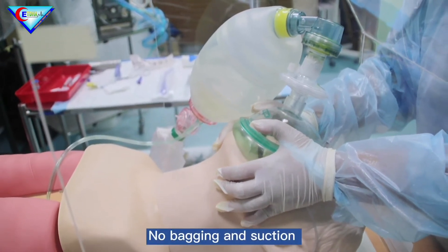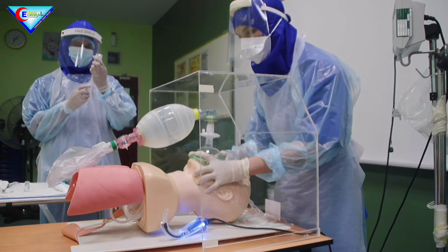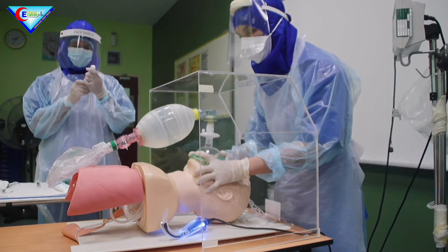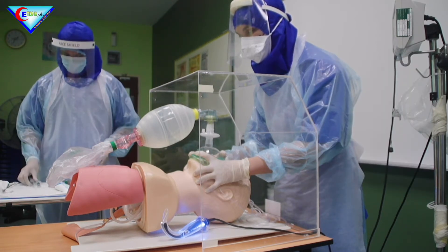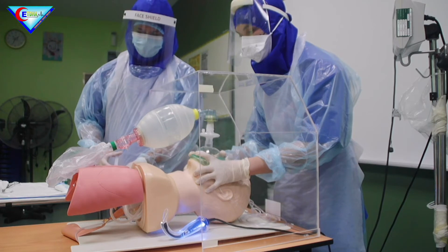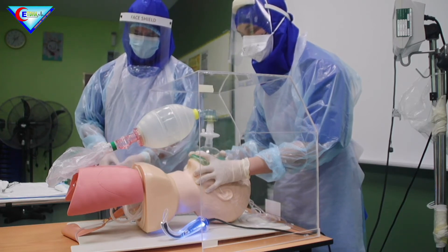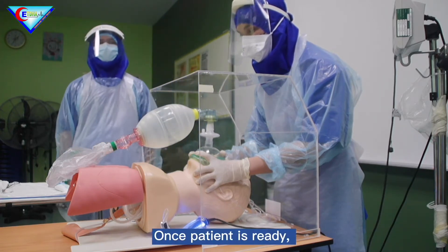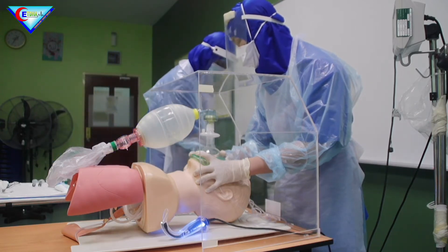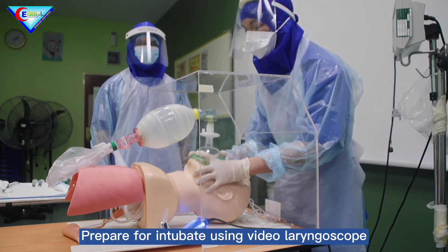No bagging and no suction. Prepare medication — give induction agent and high-dose paralytic agents such as ketamine and rocuronium. Give medication to patient. Once patient is ready, turn off the oxygen connected to the bag valve mask, and prepare for intubation using video laryngoscope.